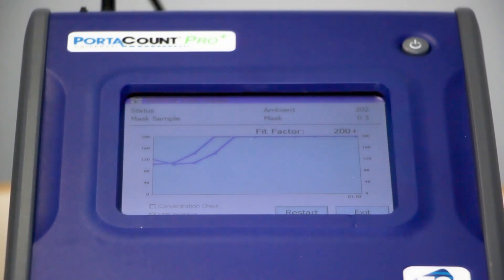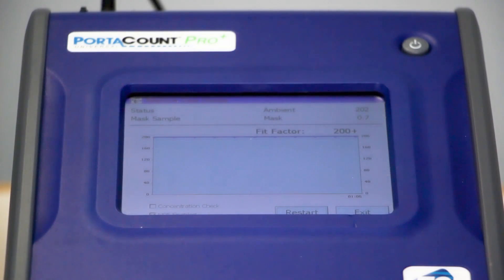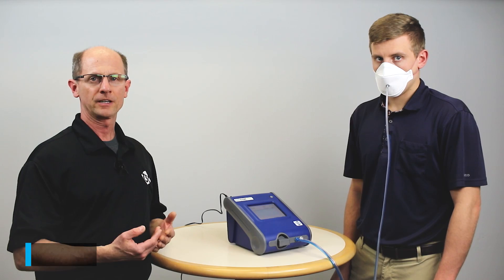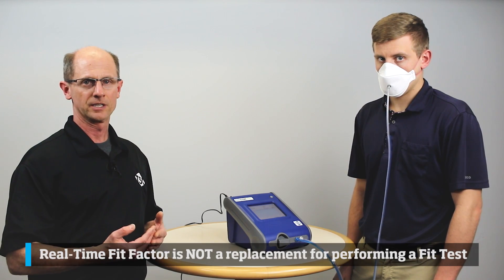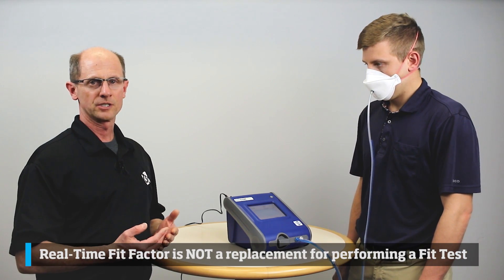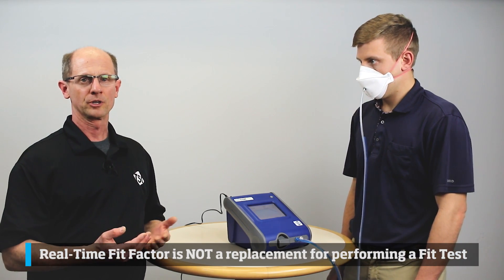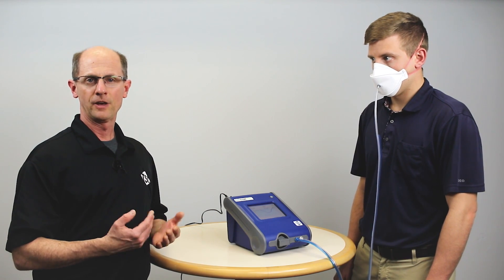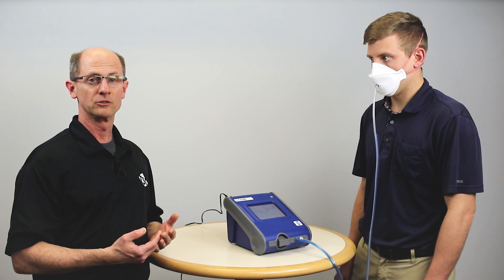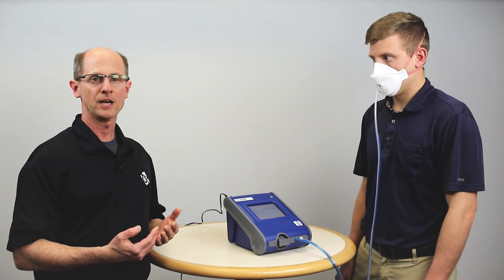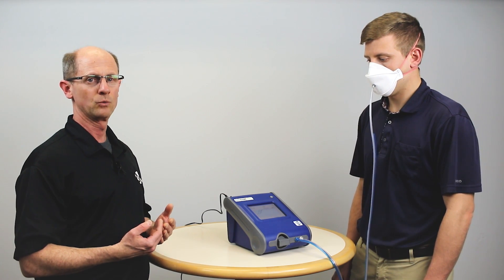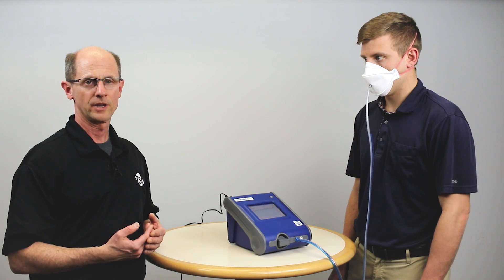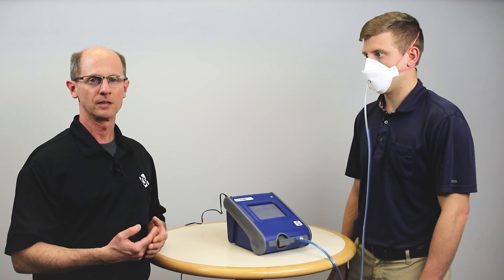Now we know we have a mask that fits and is adjusted properly, and we can go into the fit testing exercises. The real-time fit factor mode does not take the place of a fit test — it doesn't follow the exercises like an OSHA protocol. But as we've shown, using real-time fit factor display is a valuable tool: we can train a new user how to adjust the respirator, and quickly evaluate whether we have the right size for that individual before doing a full fit test.